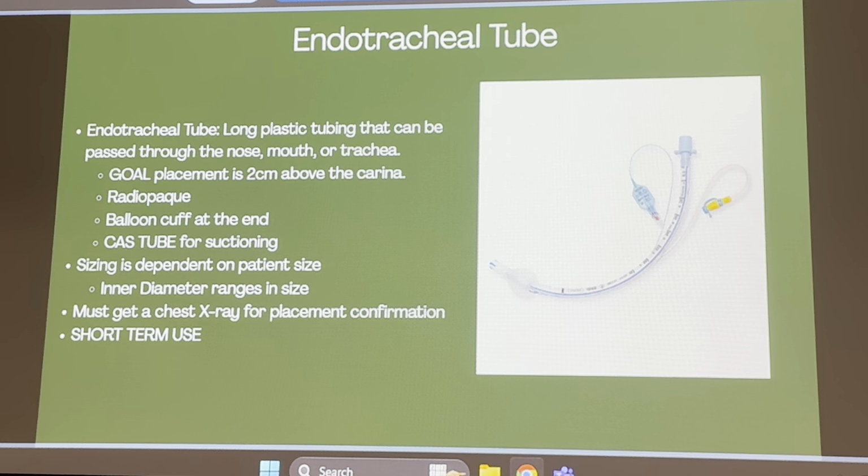Megan: So I know paramedics can, where their scope is, place some of these. Is it in nurses' scope? No, just say no for now. Is it like OPAs and? No.